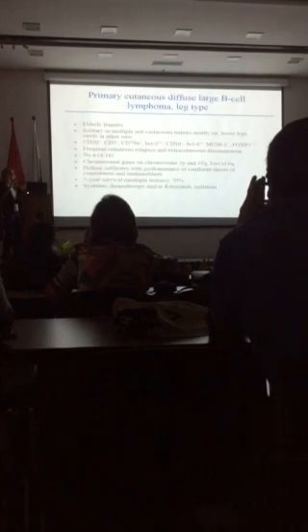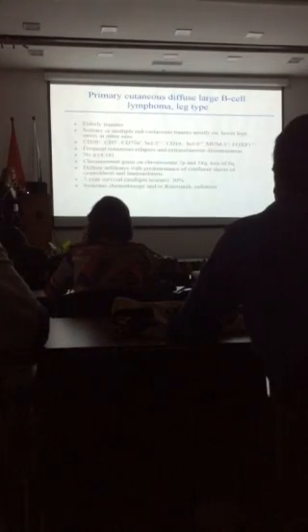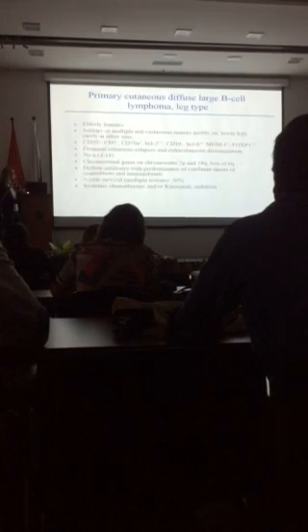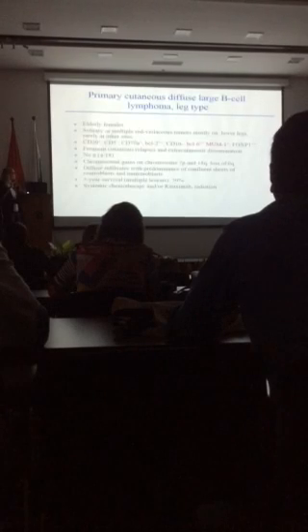So the most common diffuse large B-cell lymphoma type in the skin is the leg type. It's more common in females than in males. The phenotype can express BCL2 or can be negative. It is negative for CD10, can be positive for BCL6 or be negative, but it's MUM1 positive, and many show also FOXP1 positivity.